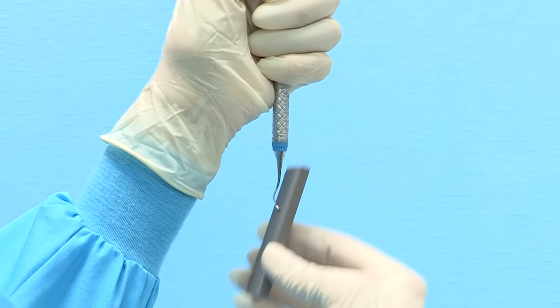Frequently sharpening your instruments will help you enjoy the many clinical benefits of scaling with instruments that are in top-notch condition.